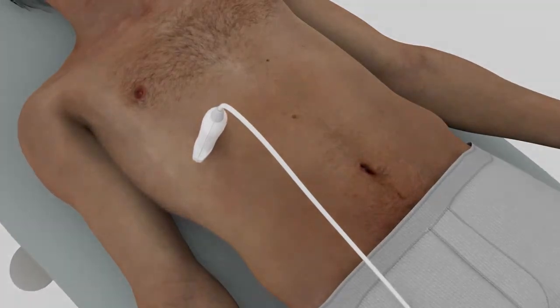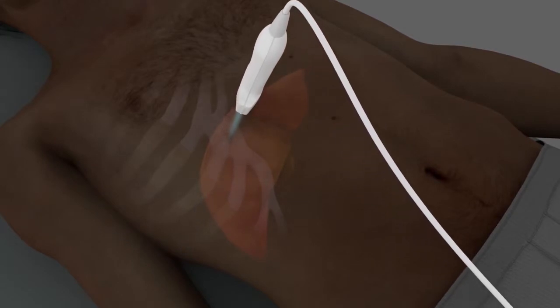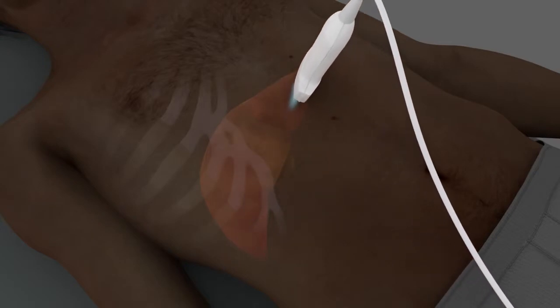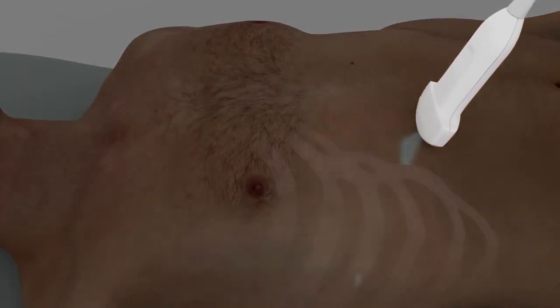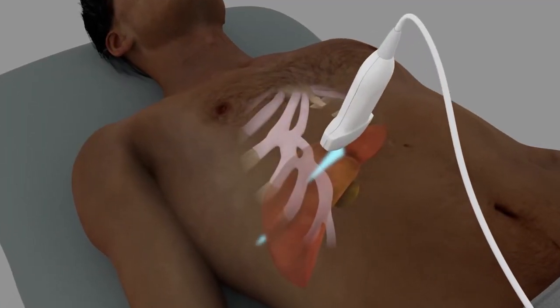The overall approach to scanning the liver is to begin at the rightmost superior margin and end at the leftmost inferior margin, scanning side to side. The liver can be viewed through the subcostal region as well as the lower intercostal spaces. The beam should be aimed toward the patient's right side.